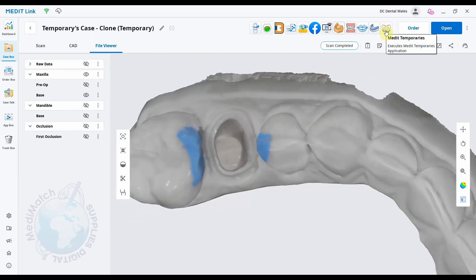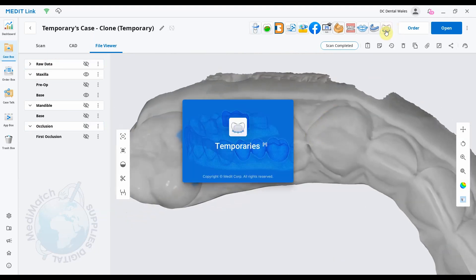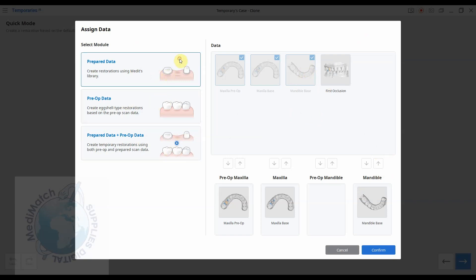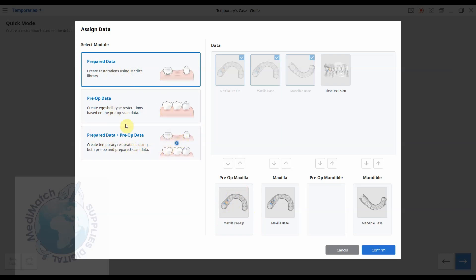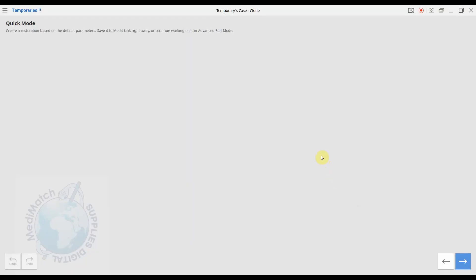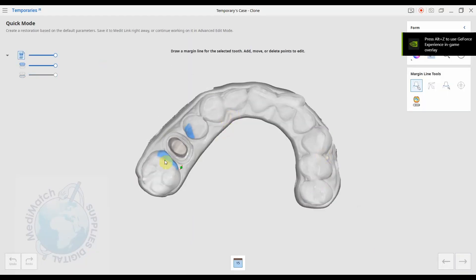I'm going to now start the temporaries app up here. You've got three options now and you've also got the option of doing bridges as well, whereas before you could only do single crowns. Okay, so we're just gonna look at a crown at the moment and see what these options do. The first option creates restorations using Medit's library. If you have got a pre-op scan, it will use the pre-op crown in place for the new restoration. If we don't want to do that and we do want to use a library model, we can just put this one up here and then press confirm.